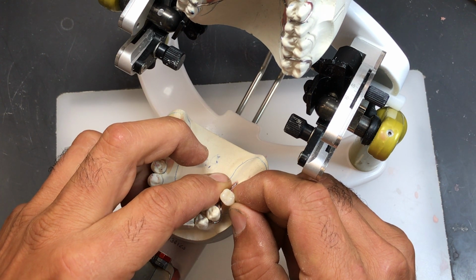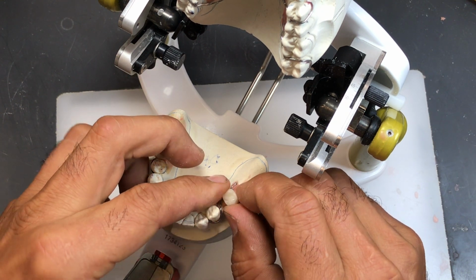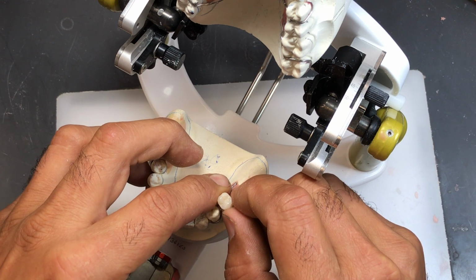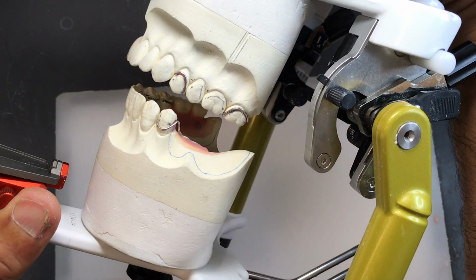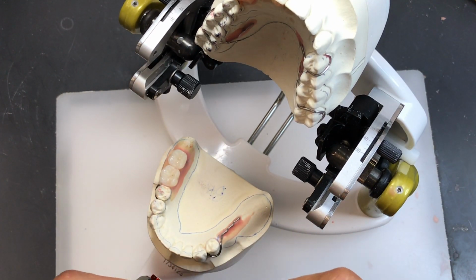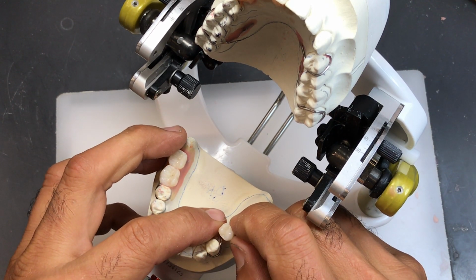So we have to go towards the distal of the first bicuspid, as well as be at a certain height so we can have this tooth slightly elevated into the bite, maybe 0.5 millimeter or so, we can grind it in a little bit. That's a lot to ask all at once, but let's see. It's not impossible, it's just a little hard. Okay, so visually assess where you think you need to grind on the tooth.